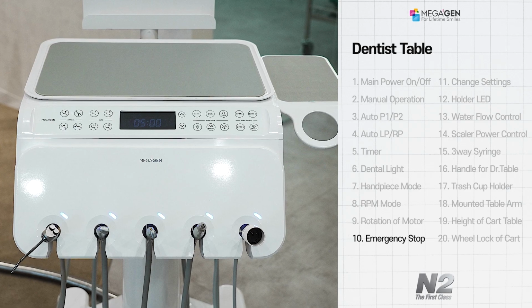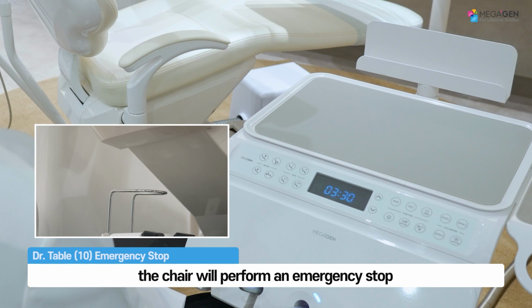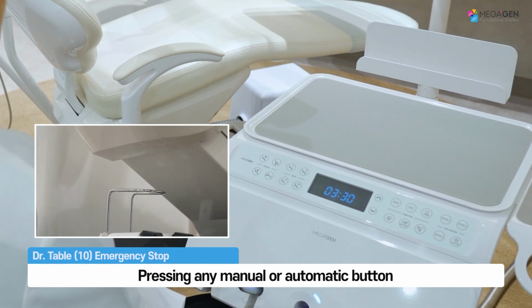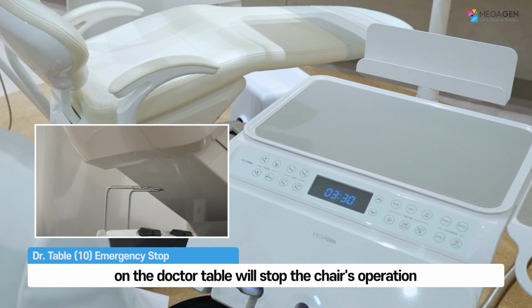Emergency stop function. If an unexpected situation, such as an external impact, occurs while the chair is lowering, the chair will perform an emergency stop. Pressing any manual or automatic button on the doctor table will stop the chair's operation.